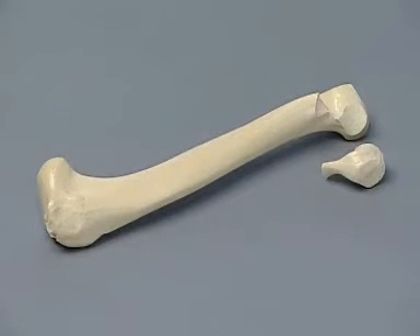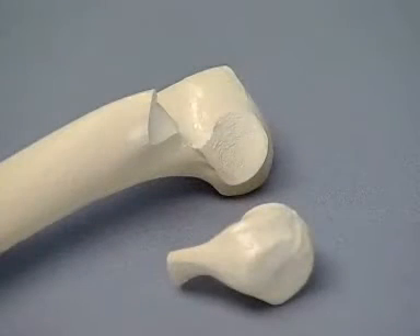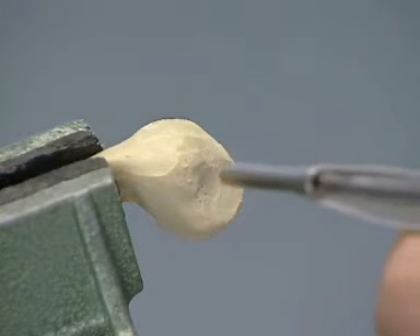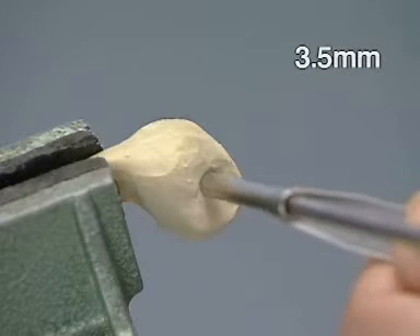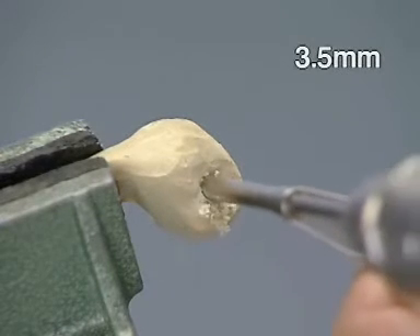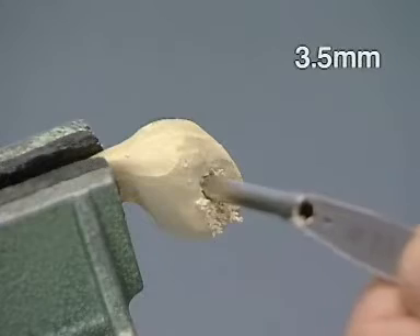This is a view of the humerus with a fracture through the lateral portion of the humeral condyle. The lateral portion of the humeral condyle has been placed in the vice and a 3.5 mm glide hole is drilled from the outside in, starting at a point distal and cranial to the epicondyle. The drill should be oriented so that it will exit in the center of the condyle.